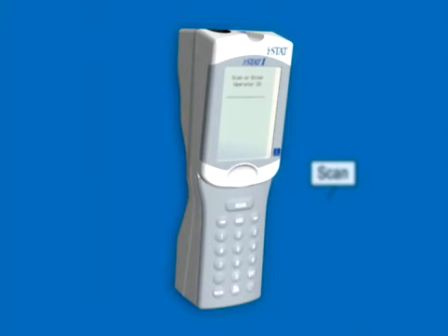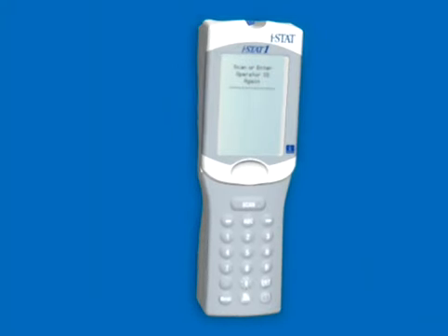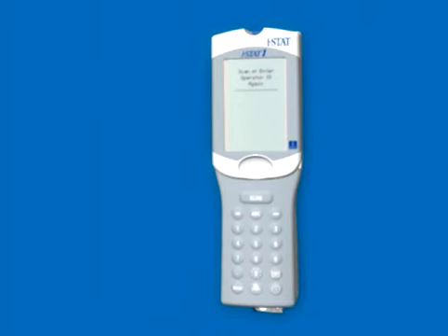When prompted, press Scan to scan the operator ID or manually enter the operator ID. If manually entered, press Enter. If enabled, the analyzer will prompt for the ID to be repeated. Press Scan to scan the patient ID or manually enter the patient ID. If manually entered, press Enter.